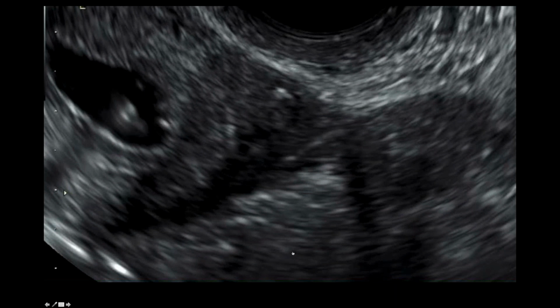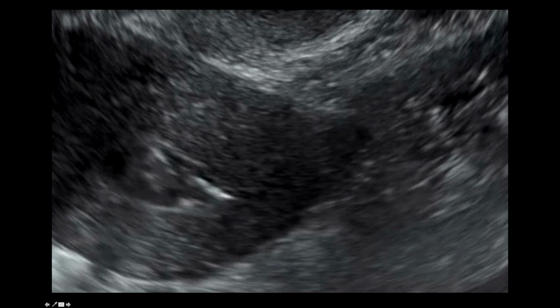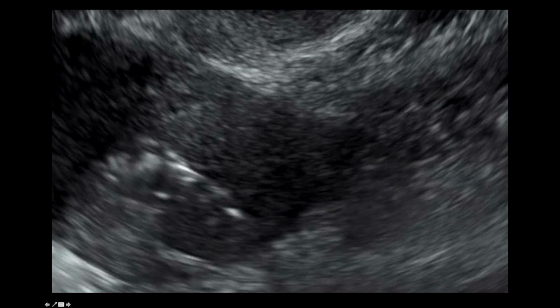Okay, so sometimes you cannot get the ovary in the same plane or same screen as your uterus. This patient's ovary was way off, and there was just no way that we were going to get her ovary in the same field of view with the cornu, okay? So then in those cases, usually what I do is I start out by looking in this area, and as much as I can see, I don't focus on the ovary. That tube is open. Okay, clearly the air is coming out.